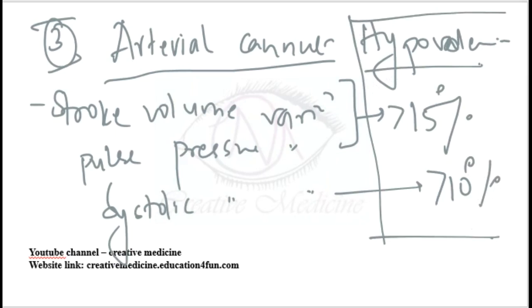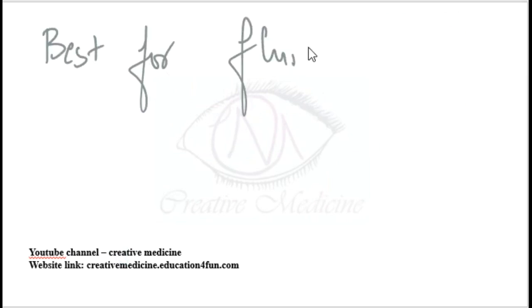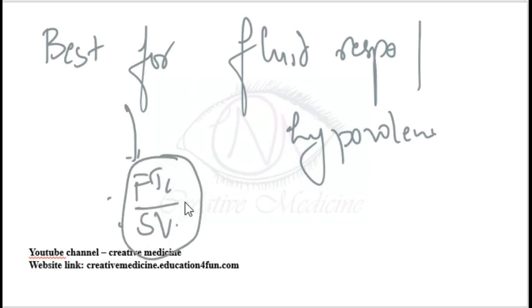So among all these, the best parameter for assessing the fluid responsiveness or to detect hypovolemia is corrected flow time across the descending aorta and stroke volume. So these two are the best parameters. So flow time across the descending aorta and stroke volume variation are best to assess the hypovolemia and fluid responsiveness. And among these two, if you have to select one, it is flow time across the descending aorta.